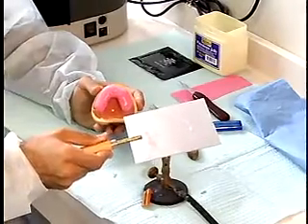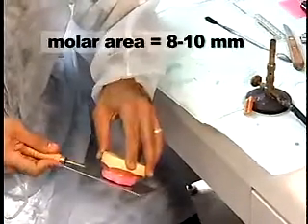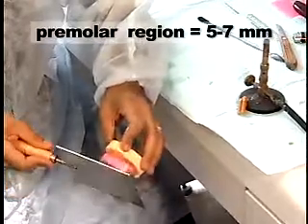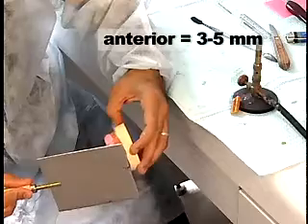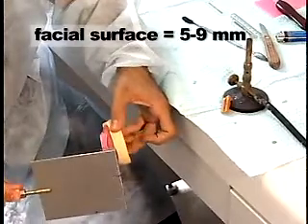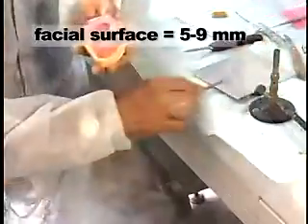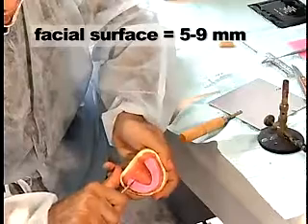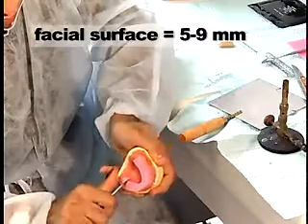The width of the occlusion rim in the molar area is 8 to 10 mm, 5 to 7 mm in the premolar region, and 3 to 5 mm in the anterior. The facial surface of the wax rim is approximately 5 to 9 mm anterior to the center of the depression of the incisive papilla.